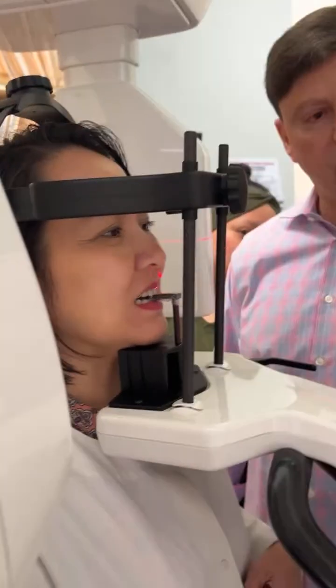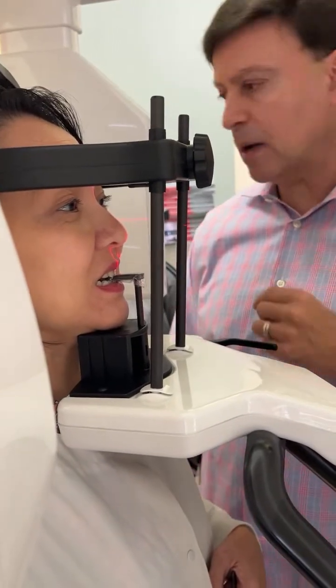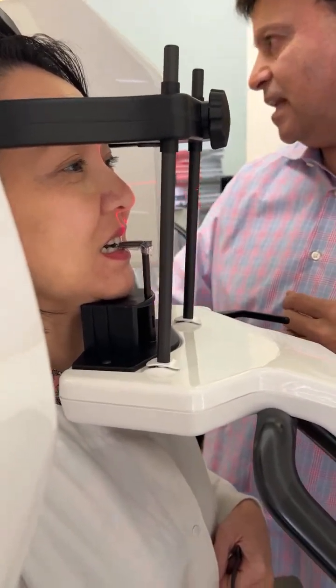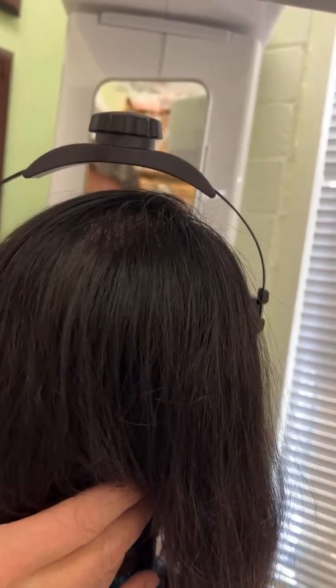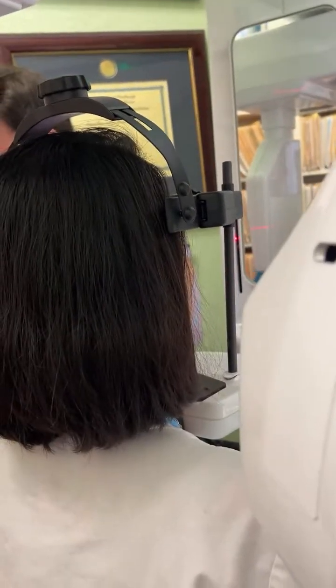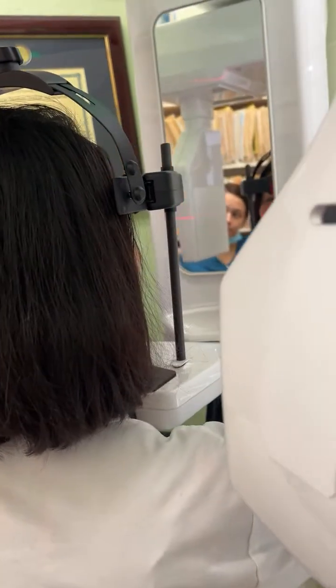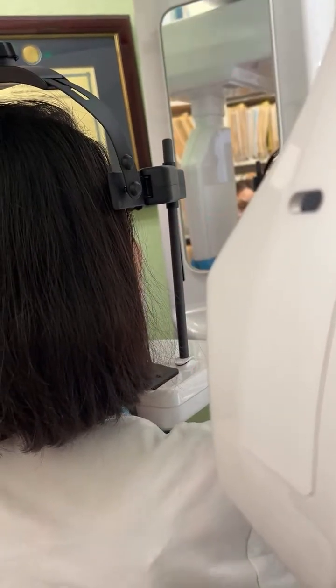Now here's the cool thing. This mirror flips out, so I don't have to walk behind her to see if she's centered. So I can adjust her here. See that? So you tell a patient, make sure that laser light is between your two big teeth in the front, and they'll adjust it for you and help. If they're not biting in that notch, you guys know from the old machine, they're over it or behind it. Their incisors need to be in that notch, the best that they can do.